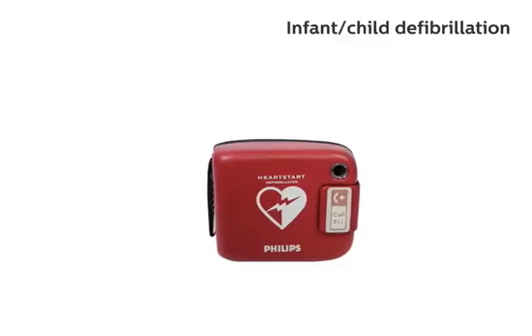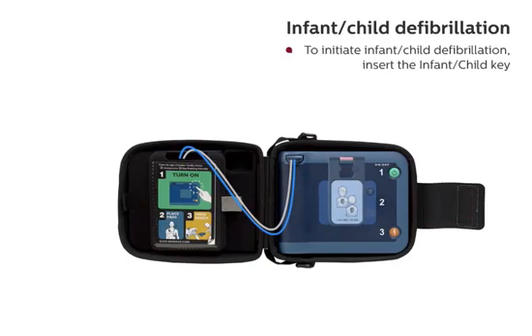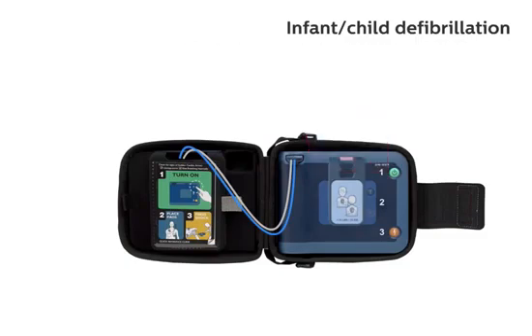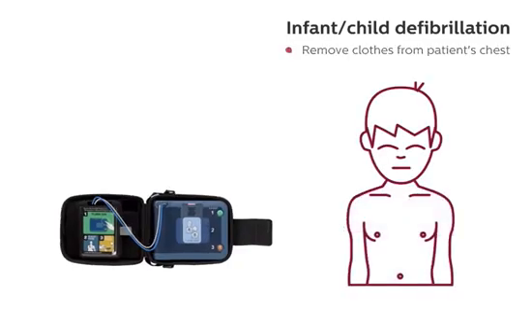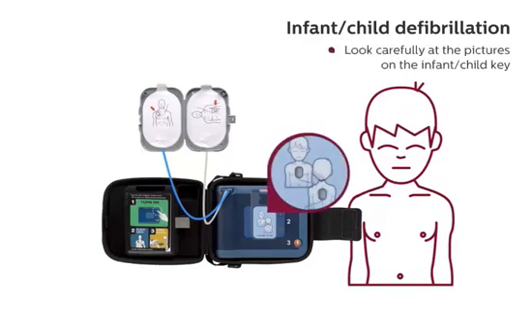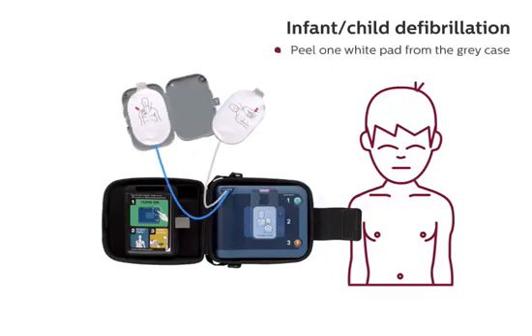To initiate infant-child defibrillation, insert the infant-child key. To start the defibrillator, press the green on-off button and follow the HeartStart FRX's voice instructions. Infant-child mode. Remove clothes from patient's chest. When patient's chest is bare, open the gray plastic case and peel off the white adhesive pads. Look carefully at the pictures on the infant-child key.